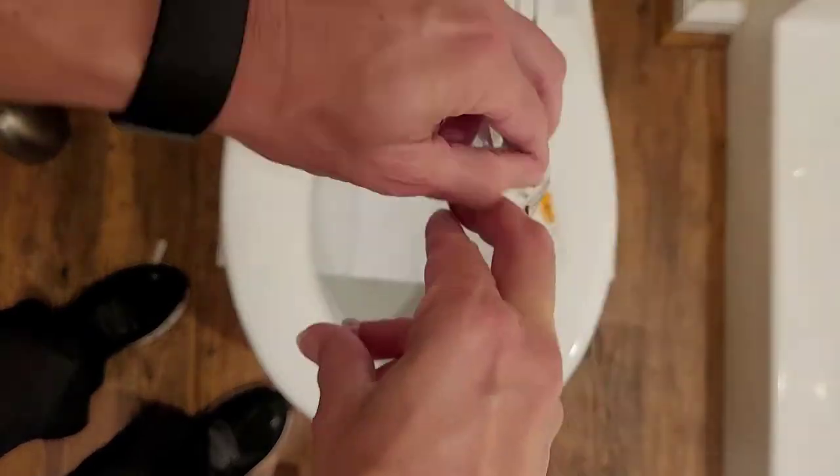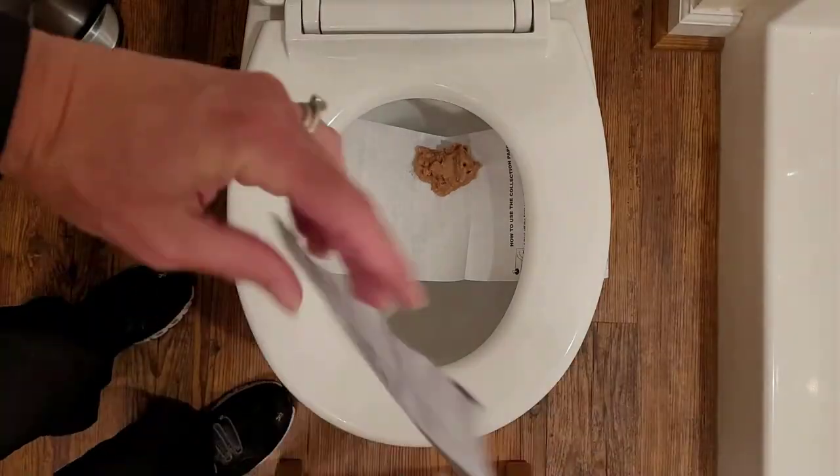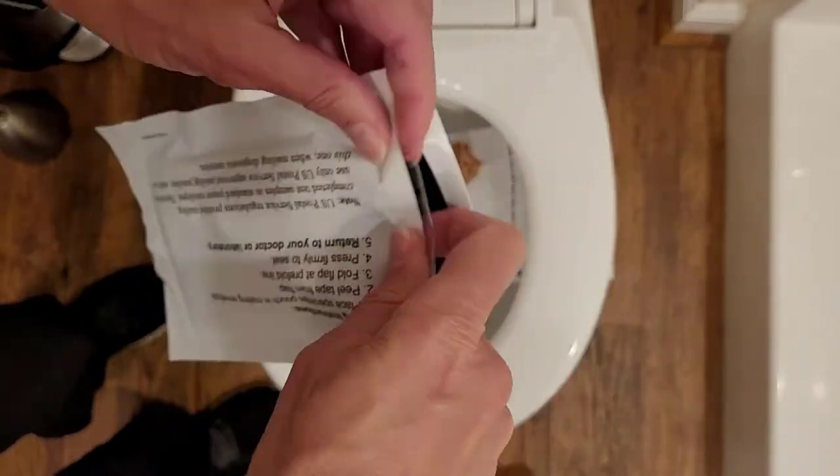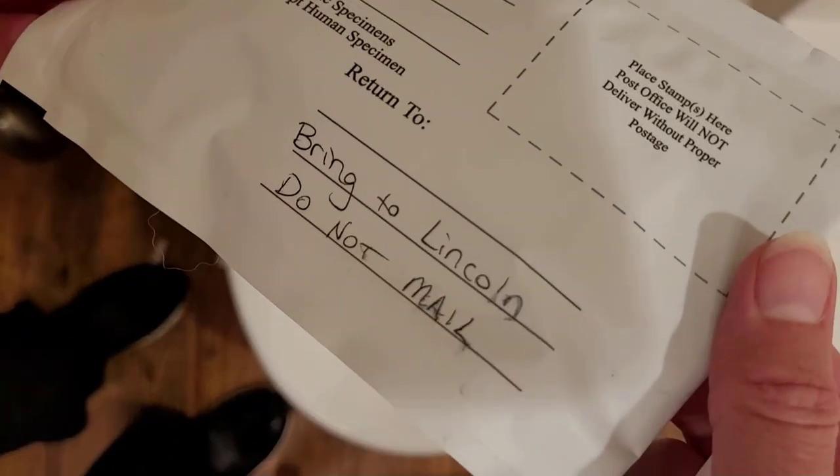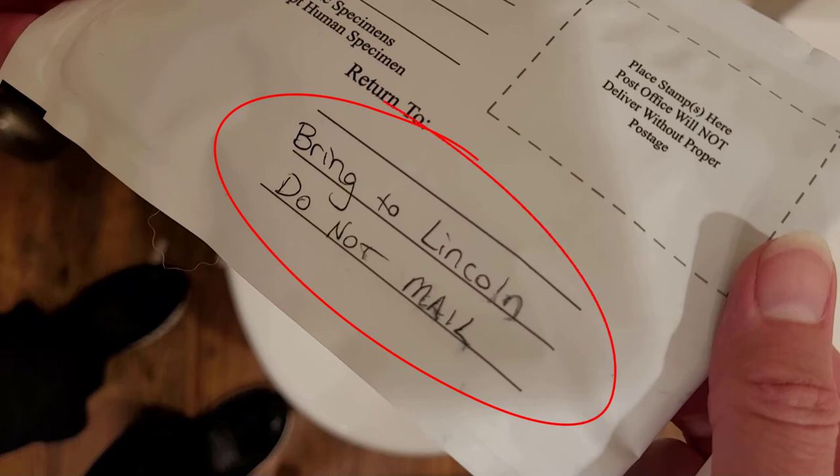Put the vial inside the plastic bag, seal that, then put it in the envelope it came in, seal that, and bring it back to Lincoln. You cannot mail it, as it will spoil in the mail because it takes too long.